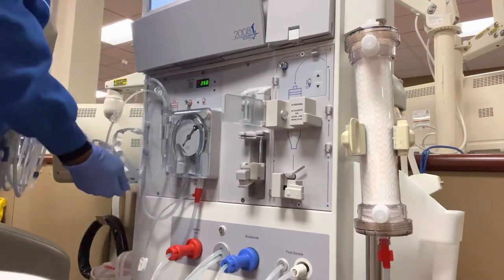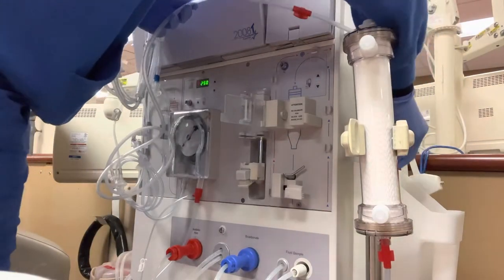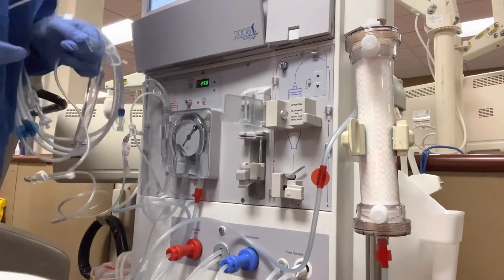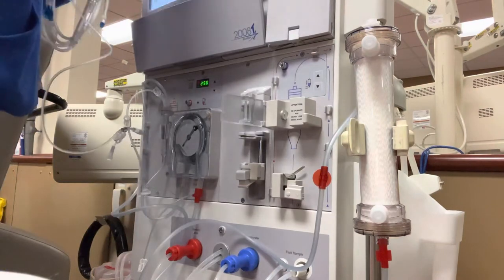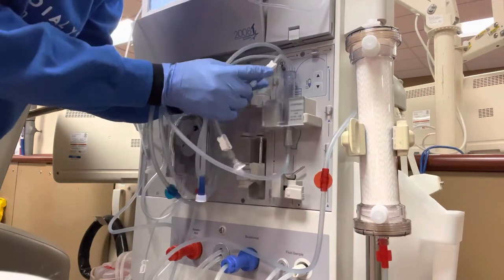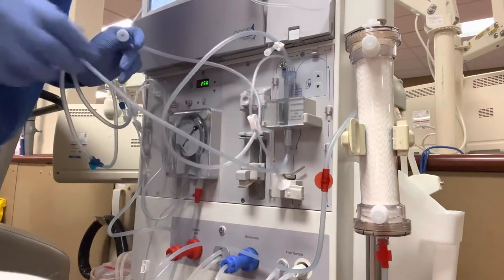Transducer lines are very important to clamp because if they are left open, you will have a wet transducer, and you're going to be trying to figure out how the heck did this happen, which happens to the best of us. It happens if you've been doing this a week, a year, a bunch of years, things happen. So just make sure your transducer lines are clamped. As you see, I'm even making sure my venous tail is clamped. Venous transducer line clamped as I go.